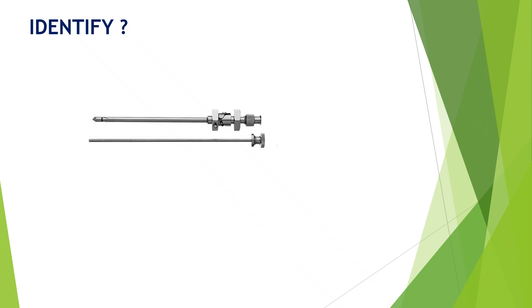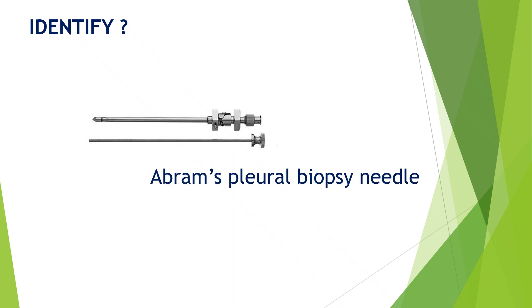Can you identify this needle? It is a stout needle, with a trocar and the cannula, and there is a knob at the top of the handle of the needle. This is Abrams pleural biopsy needle.